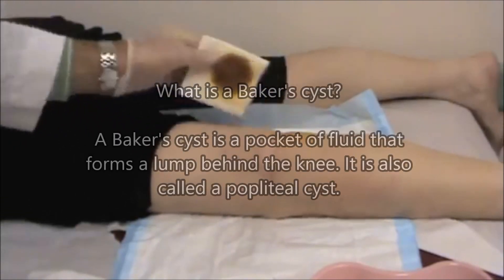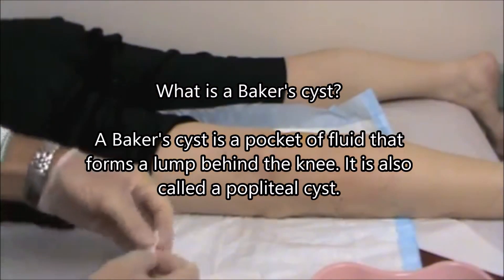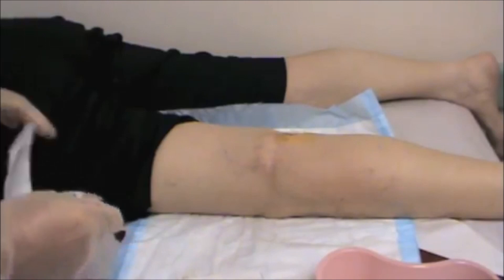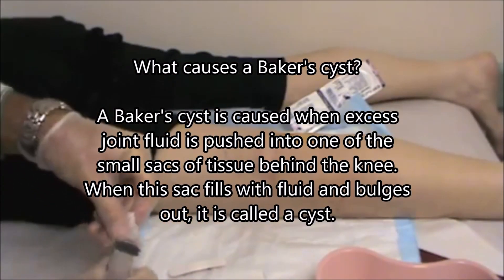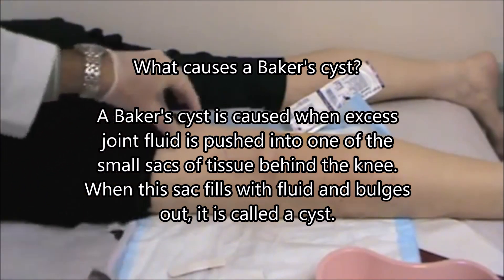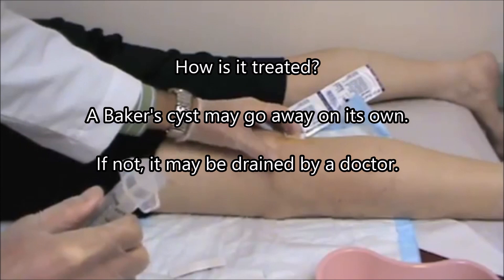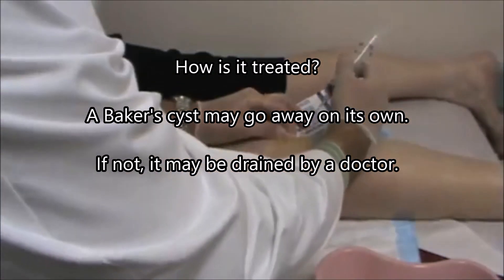Lateral of midline. This is a left knee. This is superior, inferior in this direction. I like to use a pressure anesthetic, which means to put some pressure down onto the bursa, the area of aspiration or injection.